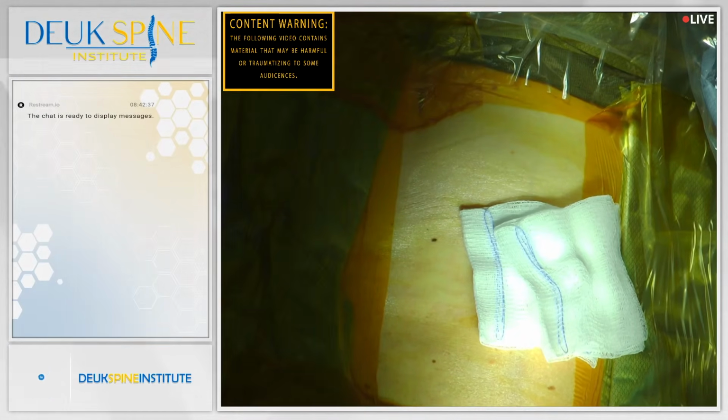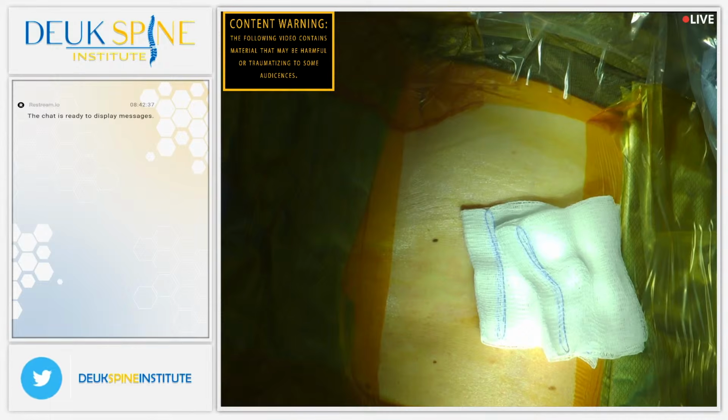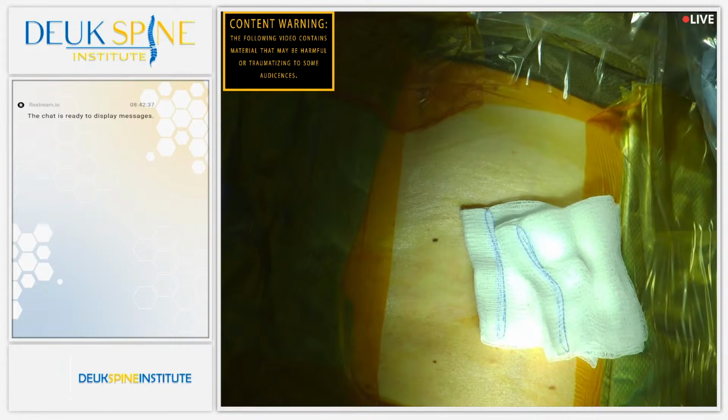December 4th, 2025. And our patient travels here from Michigan because he has horrific back pain coming from the L5-S1 disc. We call it discogenic back pain. He also has facet pain on the sides of the disc at L4-5, L5-S1. We recommended facet treatment, but he didn't want to do it.